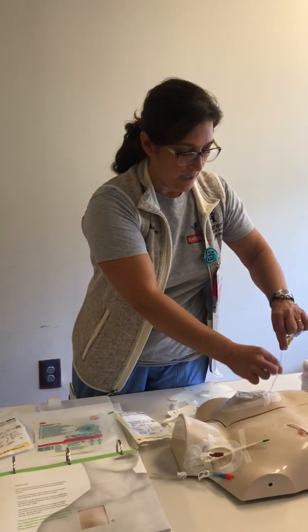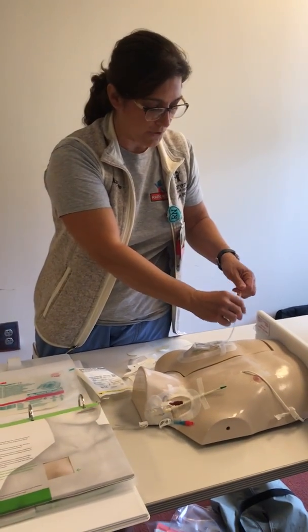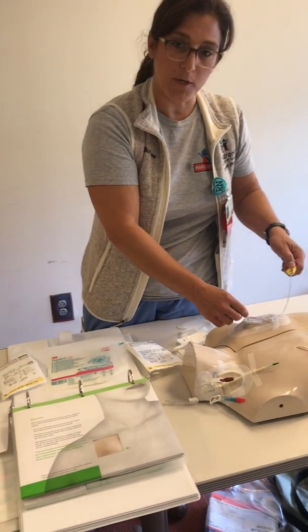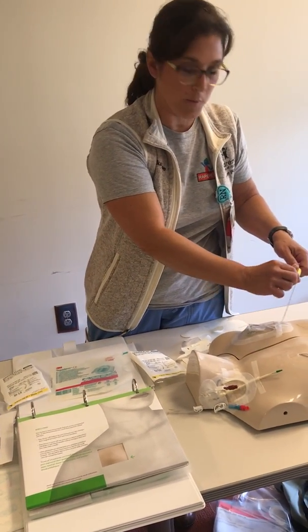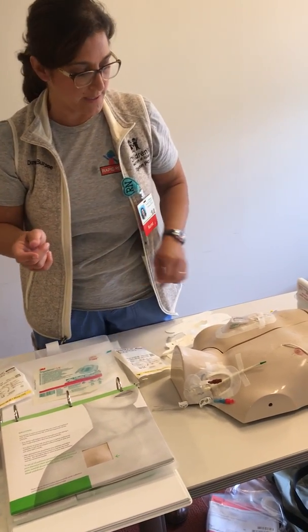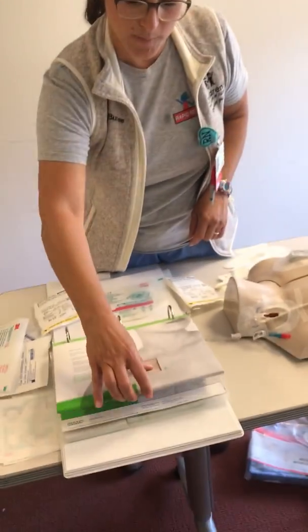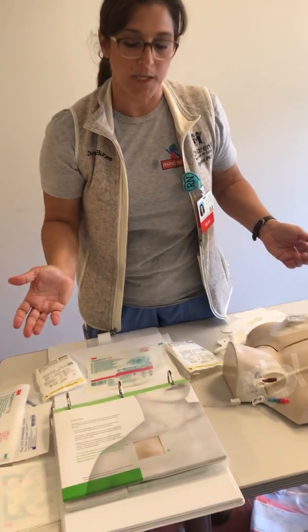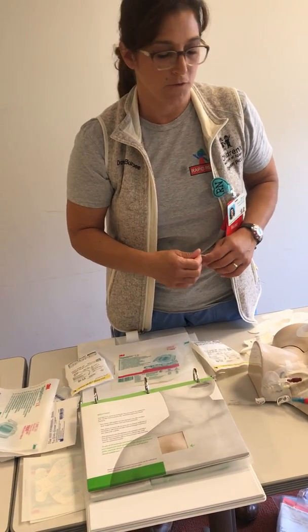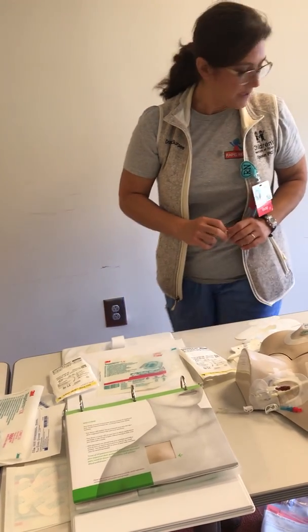This tubing is not contrast or power port compatible if you're going to use contrast. So you can use this tubing in a power port, but if you're going to put contrast through it, you can't use this one. It would be the blue tubing. Needle size and length would all be the same, but the tubing is blue for the contrast. And that's when you would use it for the power port. But if the patient's just simply coming in and they don't think any kind of contrast is going to be needed for sure, then you can just use a regular one. And I think that's it.